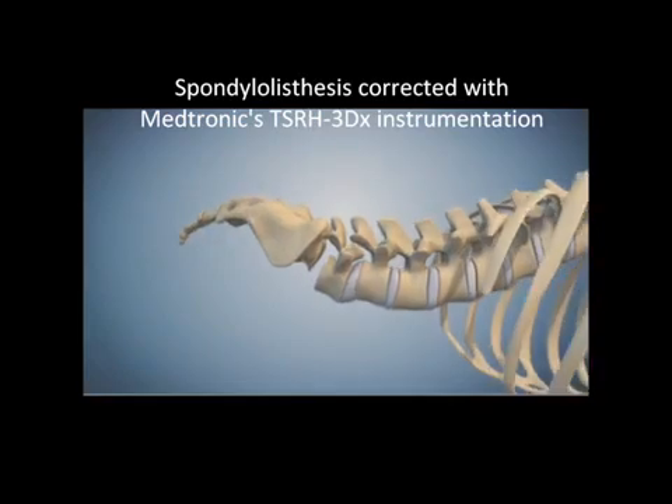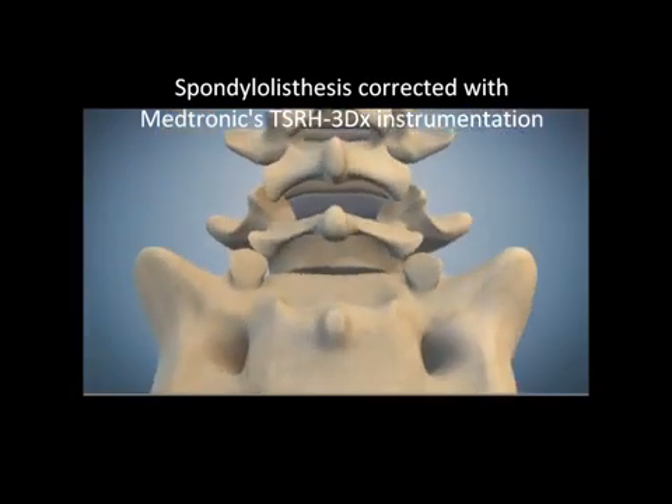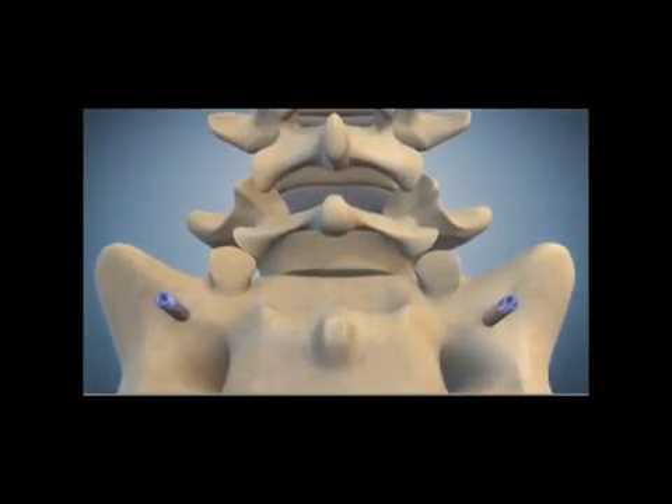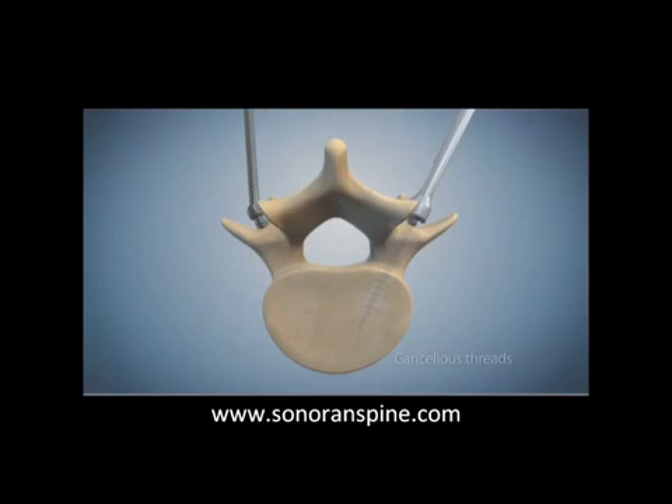This is an animation showing spondylolisthesis correction using Medtronic's 3DX instrumentation. First, straight post screws are placed into the sacrum, and the deformity or reduction screws are placed into the L5 vertebral body. Notice that there are cancellous threads in the vertebral body and cortical threads in the pedicle.